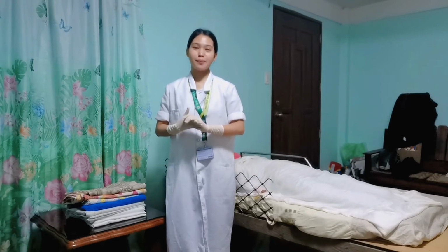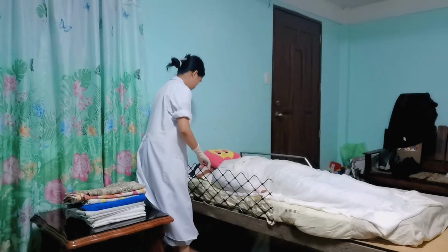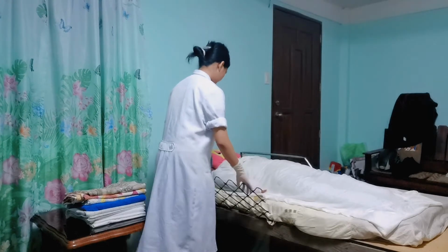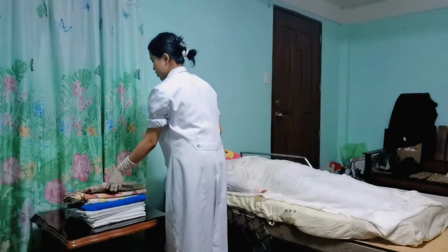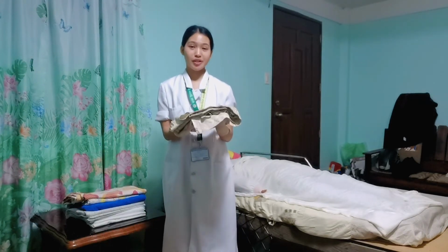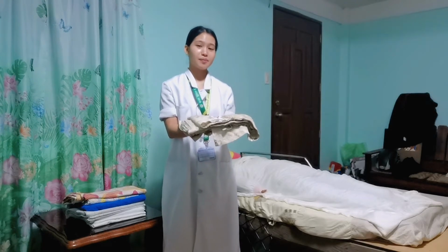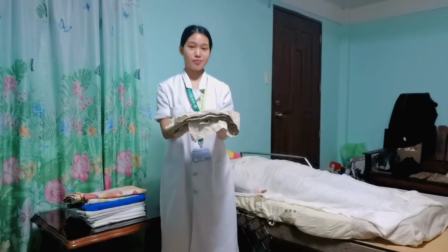The next thing that we will be doing is to grab a bath blanket to cover the patient's body. Lower the side rails and grab the bath blanket. And then, we should encourage the patient to participate by asking him or her to touch the top edge of the bath blanket.